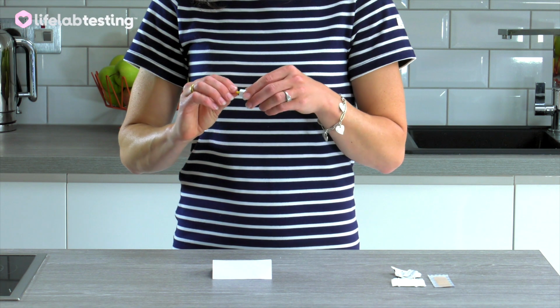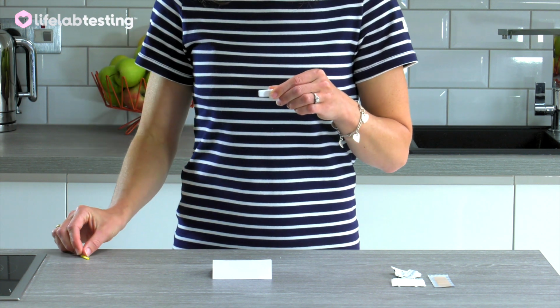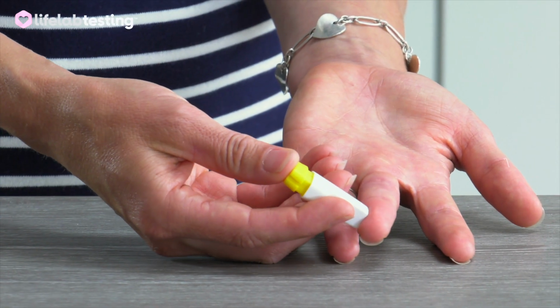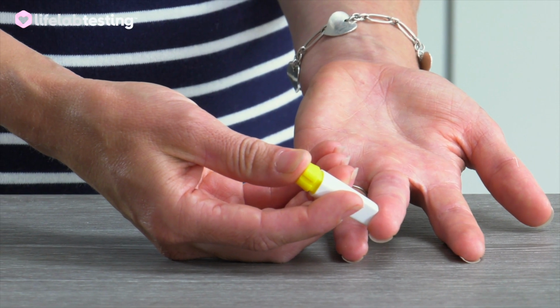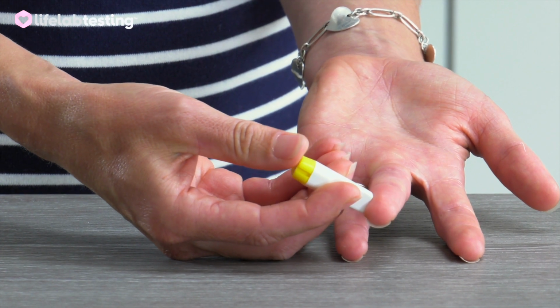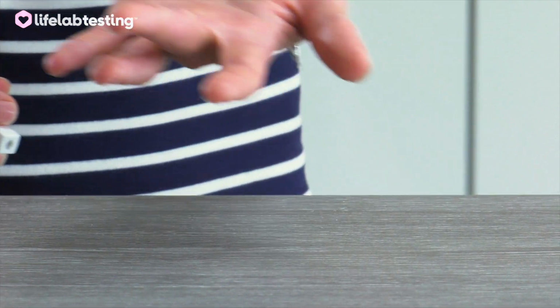Hold the lancet horizontally. Rotate the yellow protective cover one full turn and then carefully remove it. Place your hand on a stable surface. Hold the lancet diagonally against the tip of your selected finger. Press firmly with your thumb on the yellow button. This can only be pressed once.